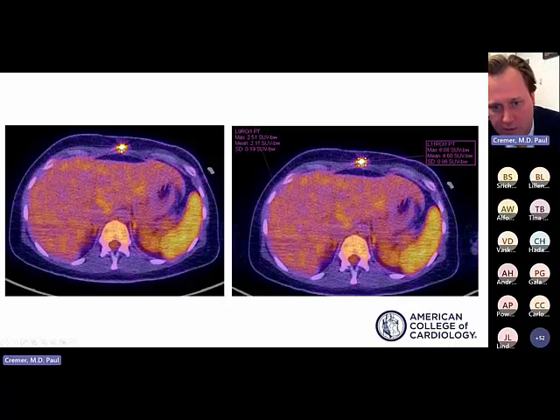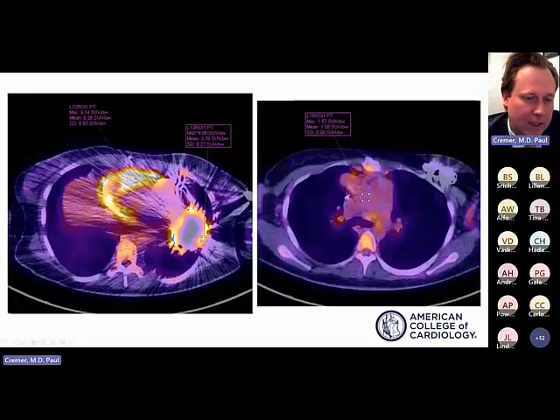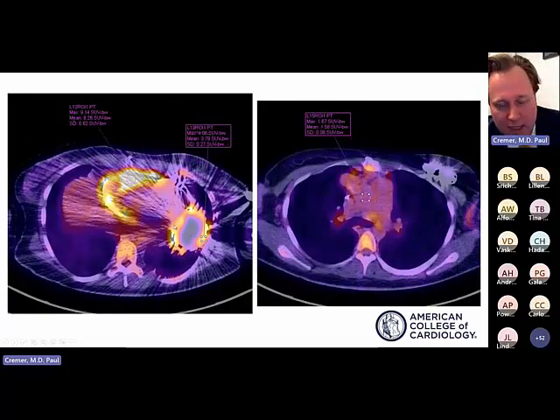So as was noted, we do use SUVs as adjunctive information and report what the background liver and blood pool signal is relative to the areas of abnormality. So here the background blood pool, liver SUV is 2.5. Around this driveline is around 6.1. Around the outflow cannula has a maximum SUV of 9, and around the pump is around 4 with a background blood pool signal around 1.7.